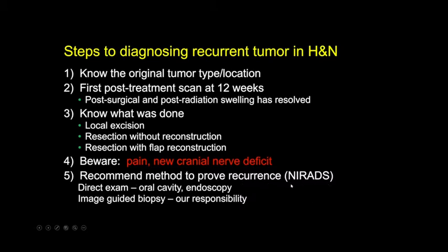It's why I like the NI-RADS approach. If you don't use NI-RADS, it doesn't matter. Still have a manner to direct the referring physician of how to prove recurrence. Either recommend direct exam and tell them exactly where, or image-guided biopsy. And that, of course, is our responsibility.